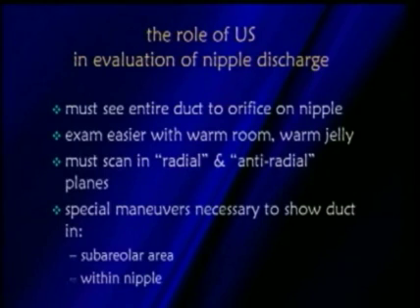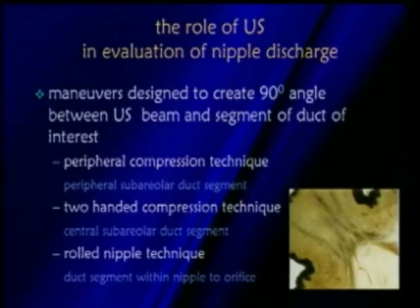We talked about special maneuvers that we can do to be able to see the ducts better, and we'll cover those. In doing these special maneuvers, we're able to visualize the ducts that are subareolar, and even lesions that can lie within the nipple. We can see those much better in doing these maneuvers.